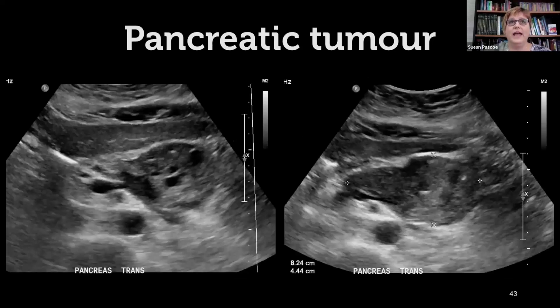Anyway, so we'll move on now to some pancreatic tumours. And I think the pancreatic tumours, again, it's nice from a completely nerd point of view, you know, hey, I can put that in a talk. It's never nice for the patient. And I always feel just completely gutted. And again, I haven't found heaps and heaps of these, but whenever I do, I know that this is seriously bad stuff going down for the patient.